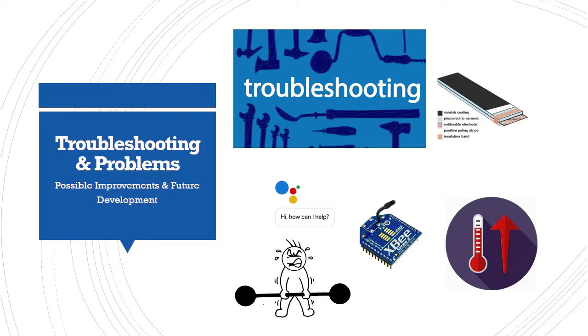During testing, the subsystems were tested separately, and the Braille actuators were initially tested with LEDs to verify their correctness. We used available apps in the App Store to test the Bluetooth shield along with the actuator. In app development, the first step was to establish a connection successfully with the device. We then tested the ability to send string messages over Bluetooth, and finally added the Google Voice Assistant function to convert speech input and send it to the device.